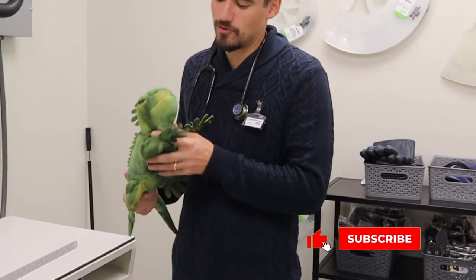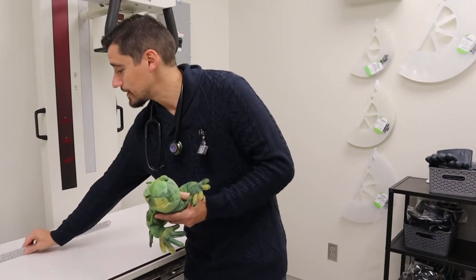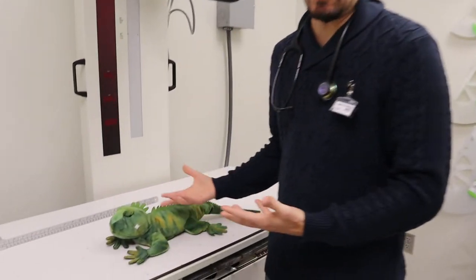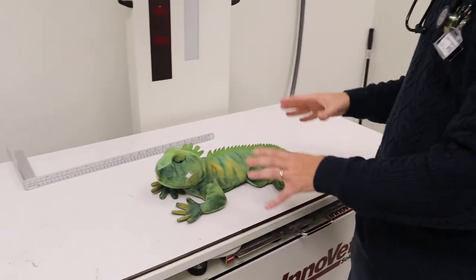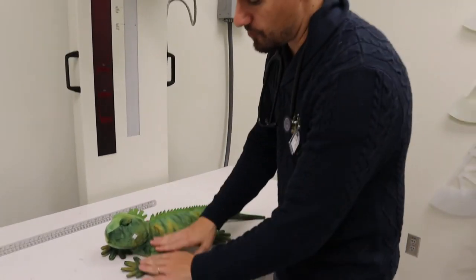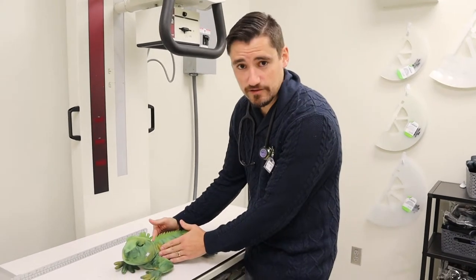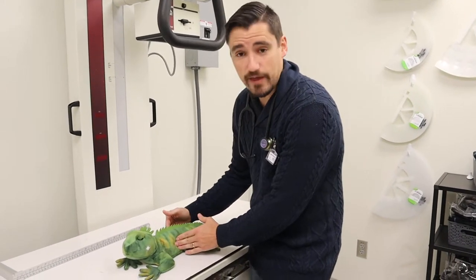We got our patient now. We'll call this guy Franklin, and Franklin doesn't feel good. When we want to x-ray a patient, we want to find out where the problem is so we're not overdoing it with our x-rays. For example, if we have a broken leg, we're going to target that leg. If we have a breathing issue — the chest, the thorax — or if we're vomiting, the abdomen.